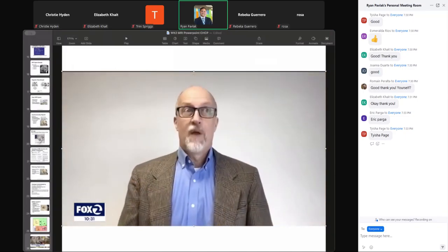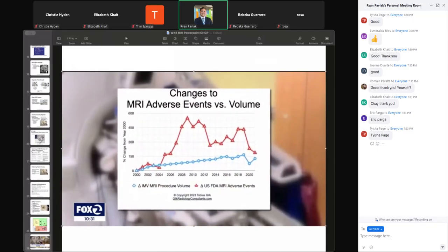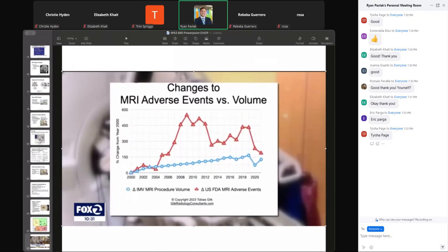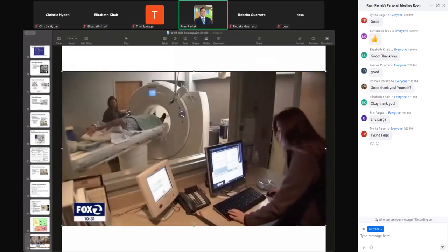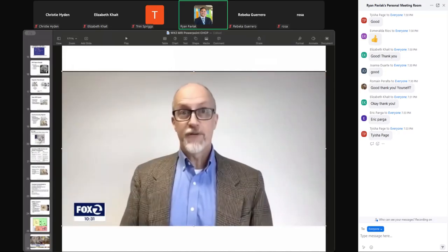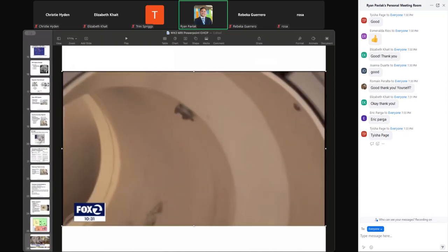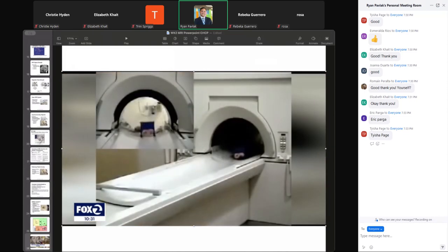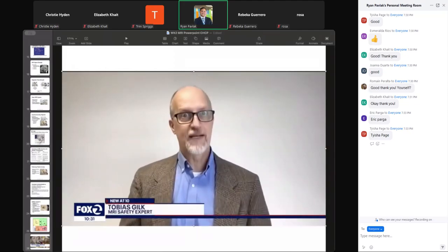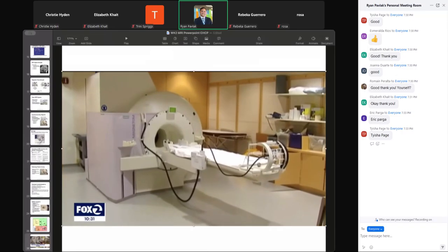Tobias Gilk is an MRI safety expert whose own research using federal data shows as the number of scans and exams increases, so do accidents, but at 3 times the rate. Gilk estimates thousands of incidents go unreported every year. Personally, I find it very frustrating. Online videos show the sheer power of the machine's magnet on anything metal. It doesn't stop being magnetically attracted. It keeps pulling and pulling and pulling, squeezing to try and get the magnetically attracted object closer to, in contact with, the MRI scanner itself.